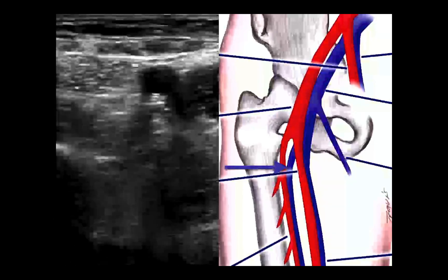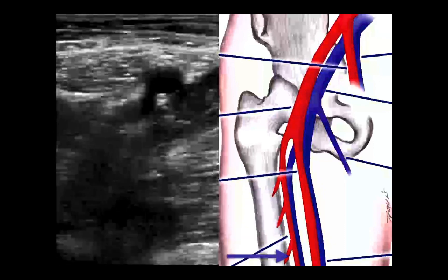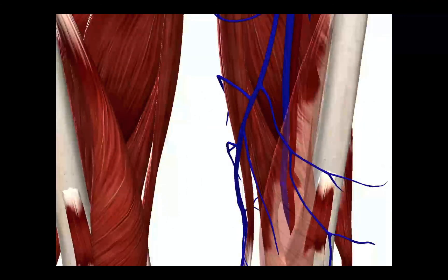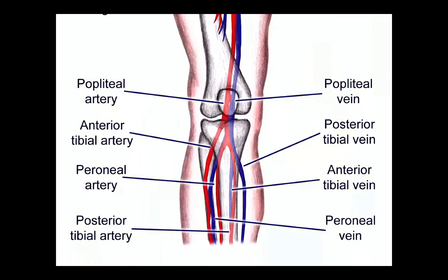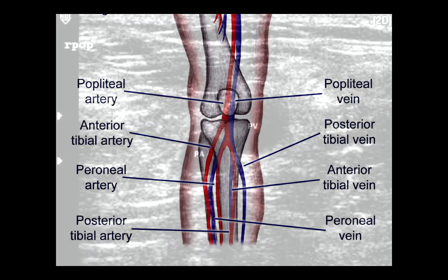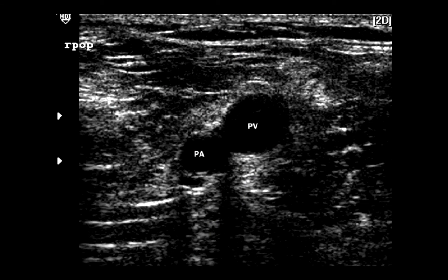We follow the femoral artery on top and the compressible femoral vein beneath it all the way down towards the knee. As we approach the knee, the artery and vein travel more medially and go to the posterior aspect of the leg through Hunter's Canal. When they reach the posterior knee, they become the popliteal artery and the popliteal vein. Notably, the probe orientation changes: where the artery was more superficial anteriorly, in the popliteal fossa the popliteal vein is more superficial and the popliteal artery is a bit deeper.